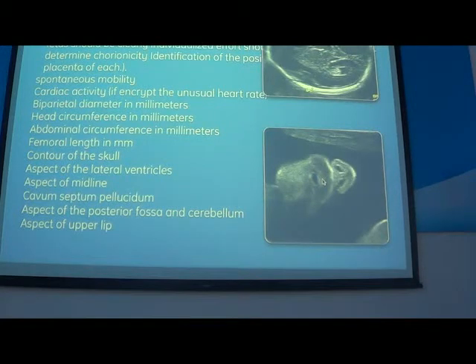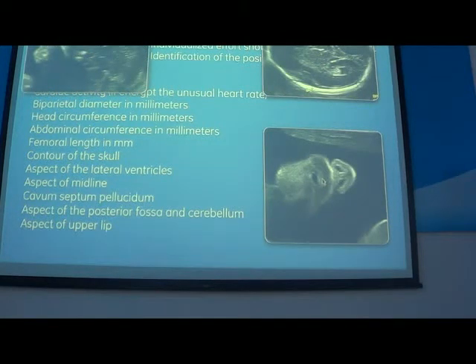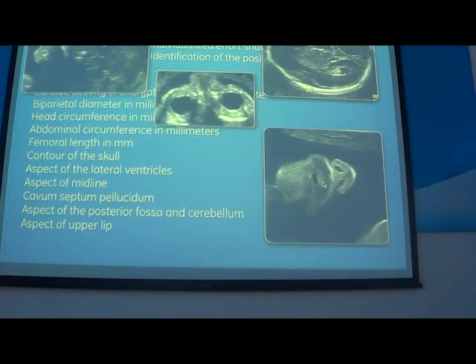What I am doing on all my screening examination, I had this view. Tuy nhiên ở trong cái hành nghề hàng ngày của tôi thì tôi làm thêm cái lát cắt profile. The view of the two orbits. Hai mắt. And I try to see one ear. Và tôi cố gắng nhìn thấy ít nhất một tai.